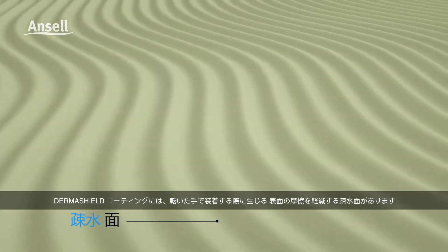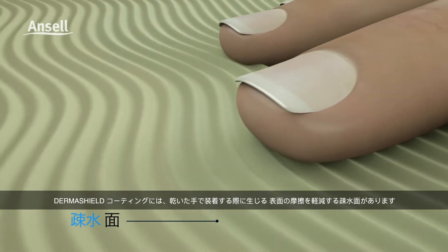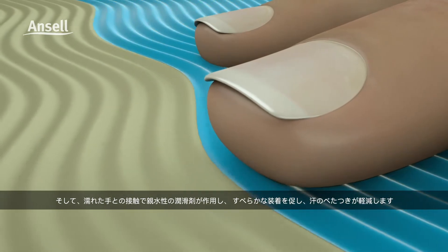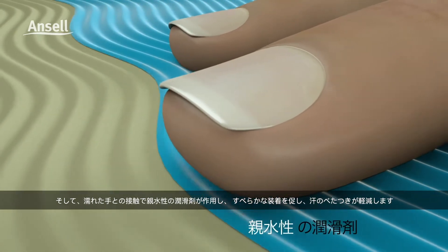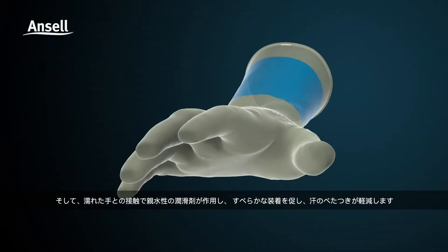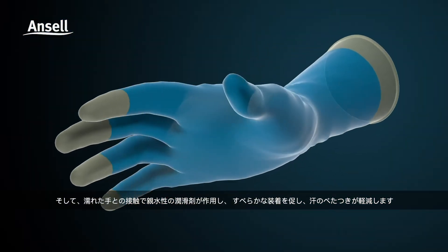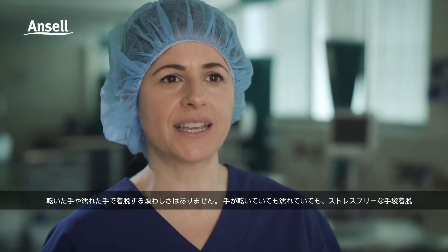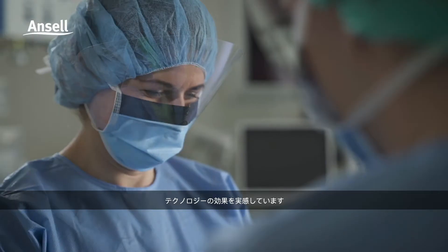Derma Shield coating has a hydrophobic surface to reduce surface area friction when donning with dry hands, while hydrophilic lubricants are activated upon contact with a damp hand to allow the hand to slide into the glove and to help minimize the feel of sweaty hands. No more frustrations with damp or dry hand donning — now that's technology that works for me.